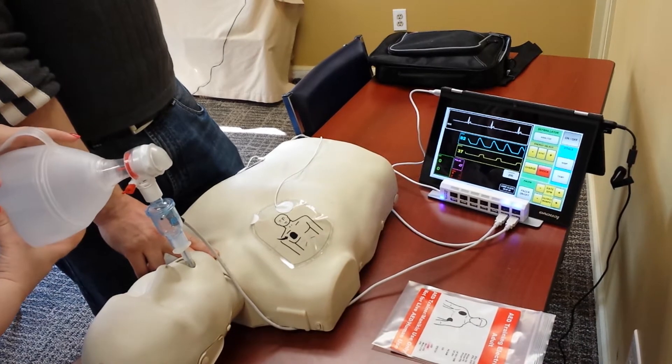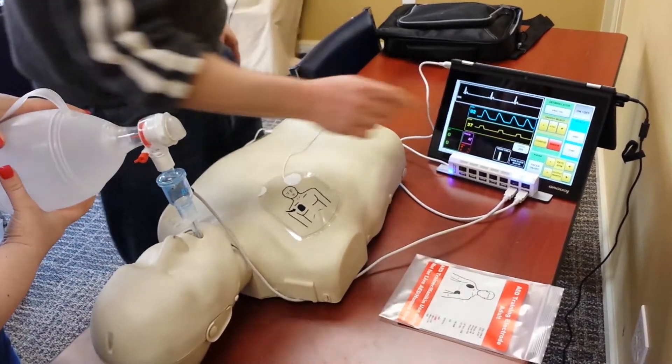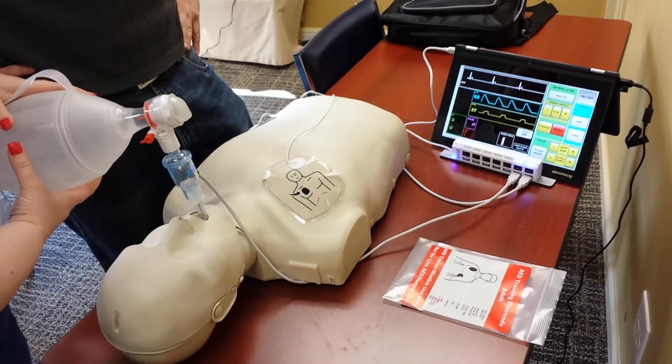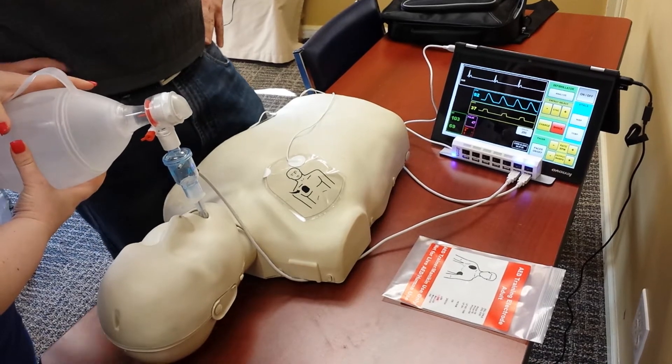There appears to be a pulse. Alright, let's check a BP. Alright, not bad. Let's take a temp.